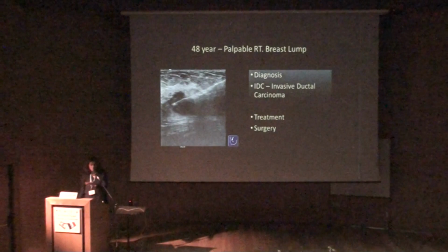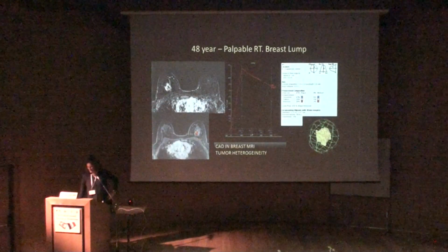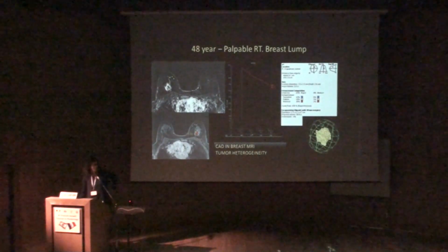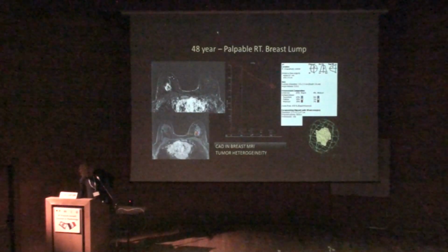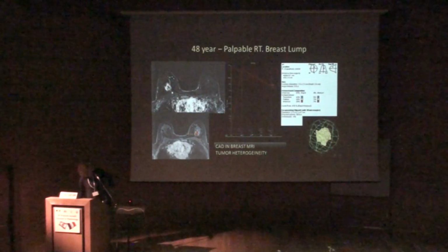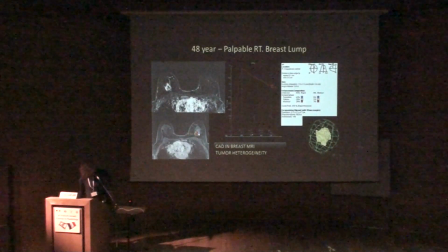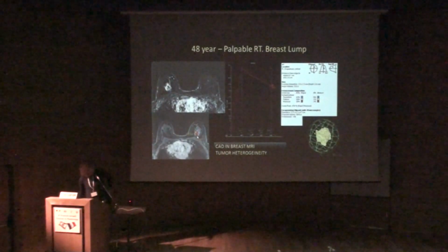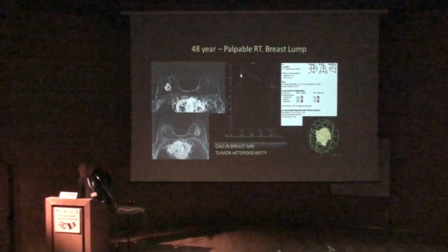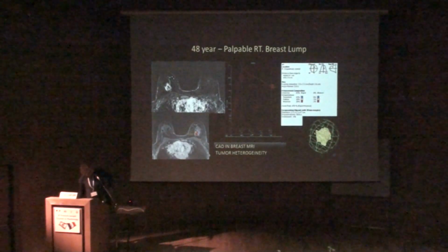So our next step, you know me, I do MRI. And this is her MRI. I had to switch the images, okay? And we can see this central lesion has central necrosis. This might be the explanation for its kind of cystic appearance. And we can see the enhancement. We can see that it has the typical rapid wash in and wash out. However, again, it is heterogeneous.